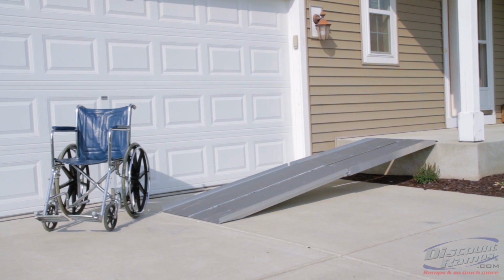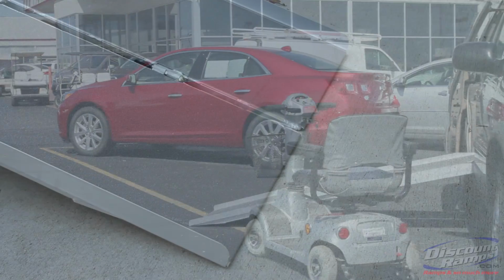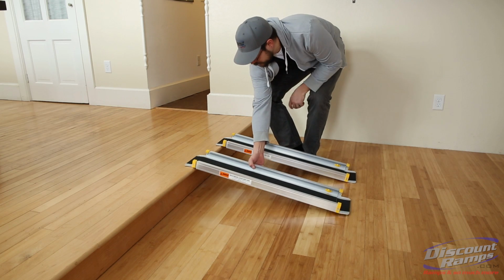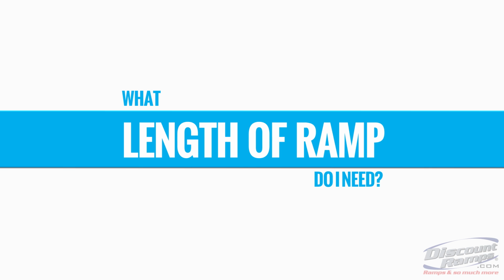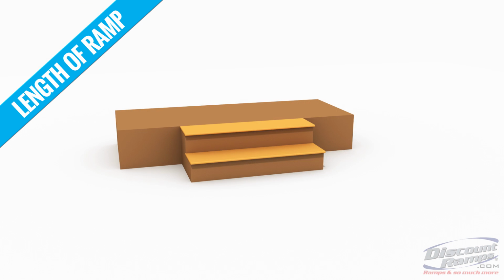If you are shopping for a wheelchair or scooter ramp, you have a vast selection to choose from. In this video, we will go over the different types of ramps that are available for wheelchairs, scooters, and other mobility devices. The first question you should ask yourself is, what length of ramp do I need? The length is extremely important. It will determine how safe and easy to use the ramp will be.